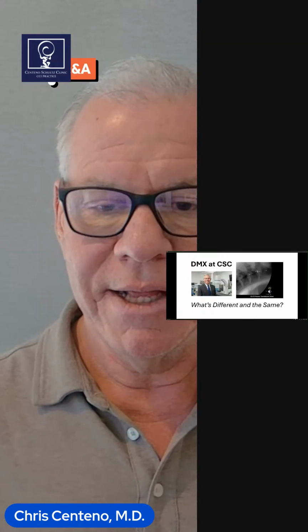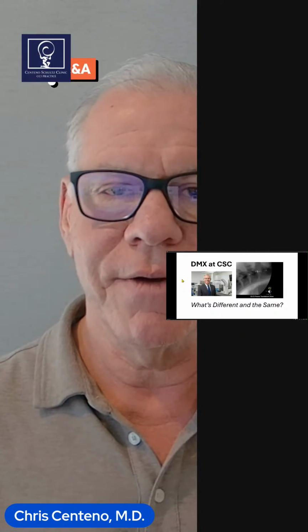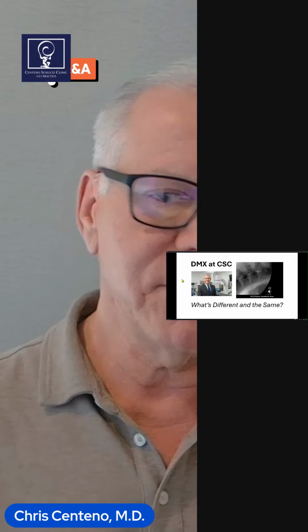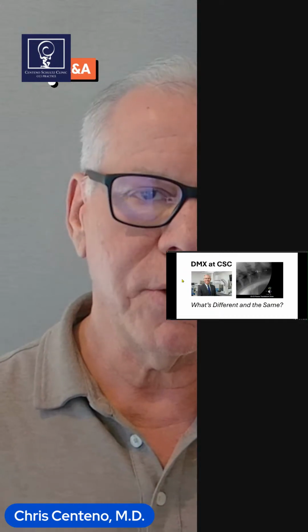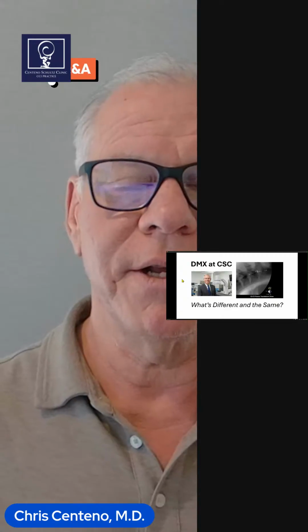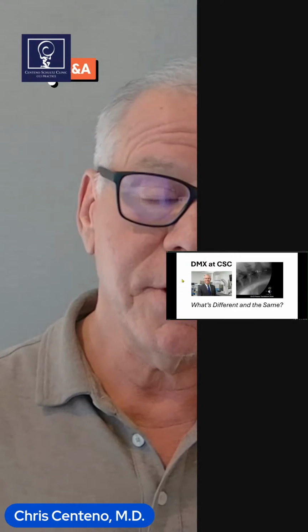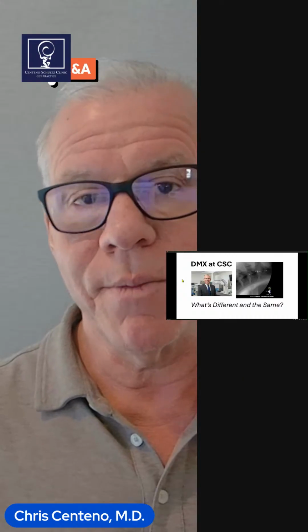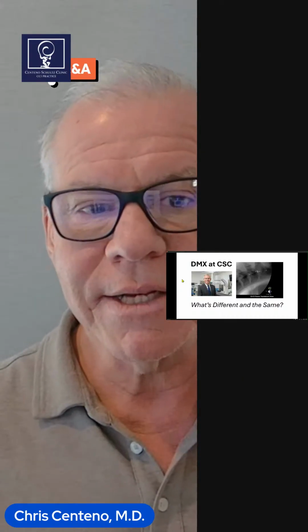So let's start getting into this topic today. Digital motion X-ray or video fluoroscopy, DMX, is a pretty essential component of a craniocervical instability diagnosis. Now, there are other ways you can get there too. You can try cervical flexion extension, upright MRI, or just flexion extension X-rays.